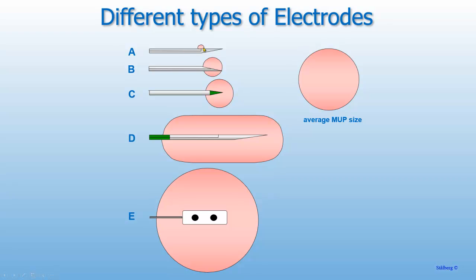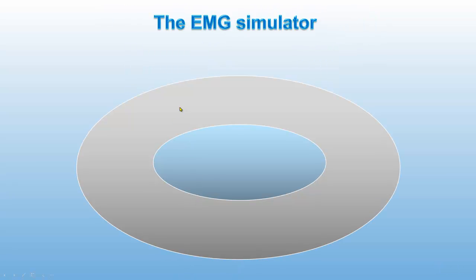We record the activity with different magnification, from small single fiber EMG, a few hundred micron, to a few millimeters with concentric and monopolar electrode, to a larger uptake area with a cannula recording called macro EMG, and the superficial 1 or 2 centimeter layer of muscle by means of surface electrode.